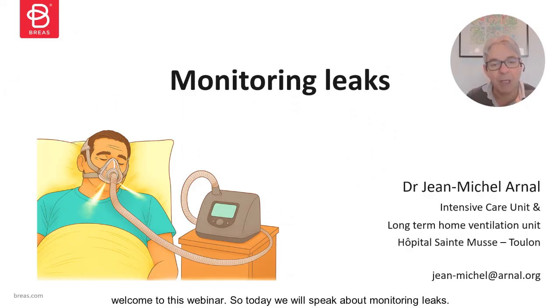Welcome to this webinar. Today we will speak about monitoring leaks.